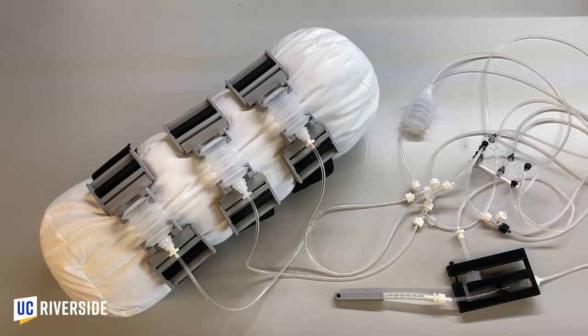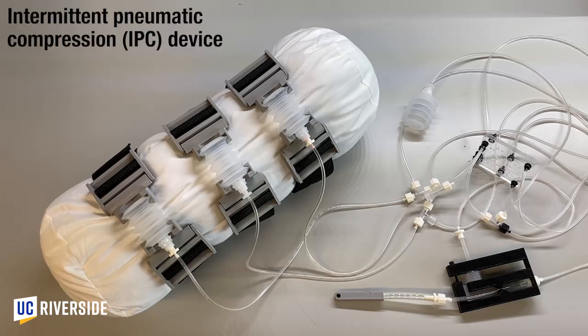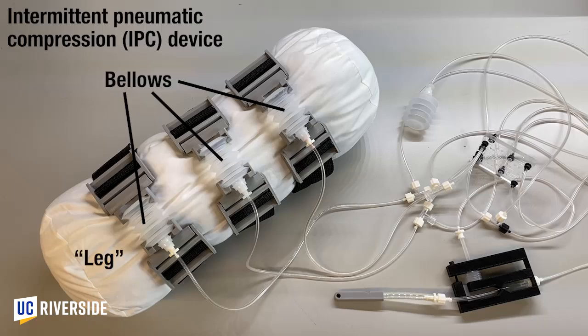In this video, we use our pneumatic error detector to sense problems in the operation of a model medical device, an intermittent pneumatic compression or IPC device. An IPC device applies periodic compressions to the wearer's leg to encourage blood flow and reduce the risk of clot formation. Our model IPC device consists of 3 plastic bellows mounted on nylon straps that wrap around a simulated leg.